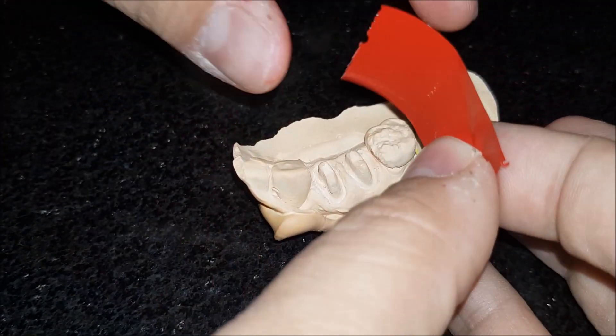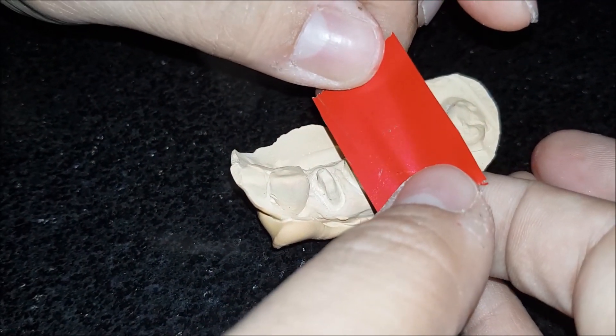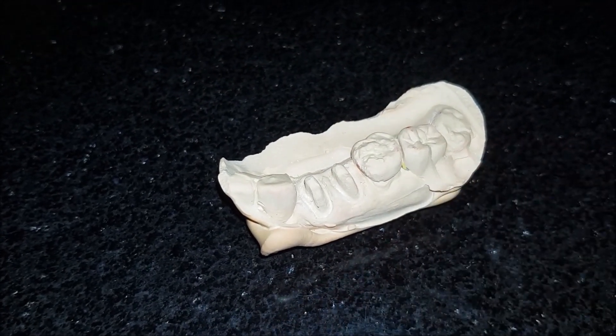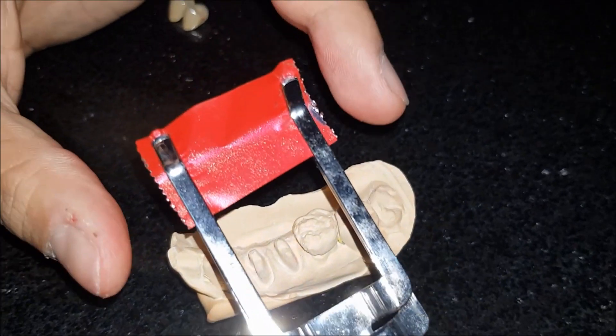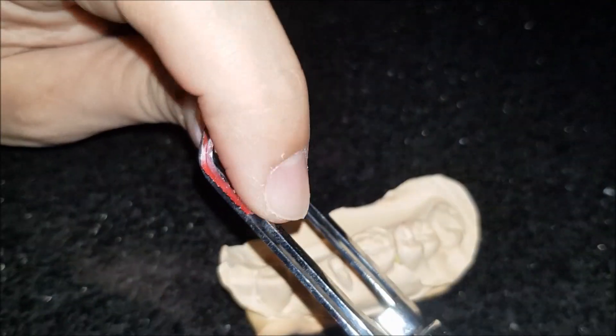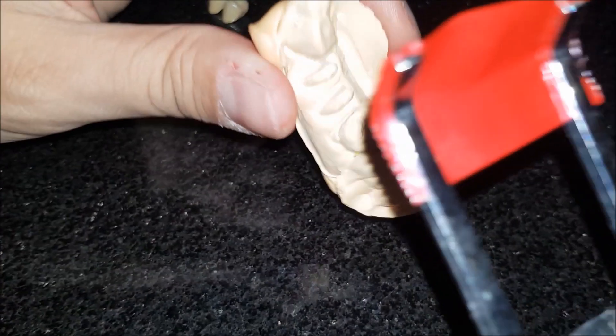Doing it here on the cast is very easy because I can control the position and the seating. When doing this with the foil in the mouth, it gets a lot more difficult, and that is why from Bausch you have these approximating forceps. These can be used intraorally and they sit on the proximal surfaces.